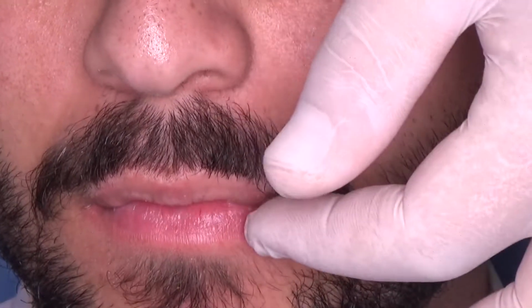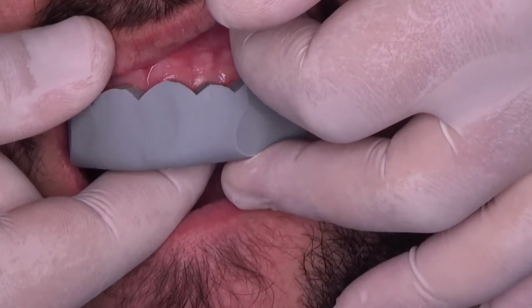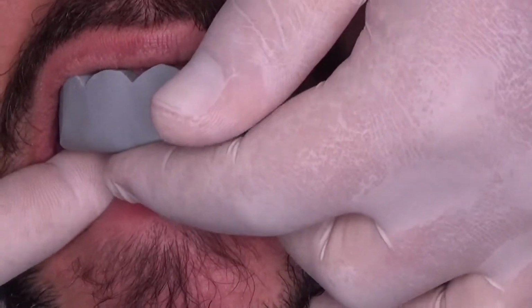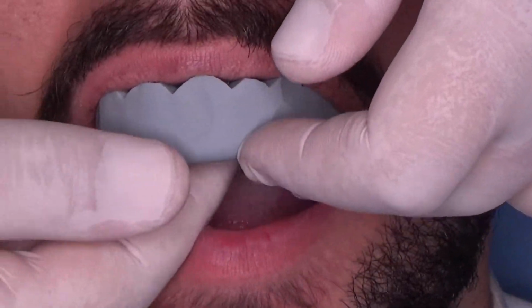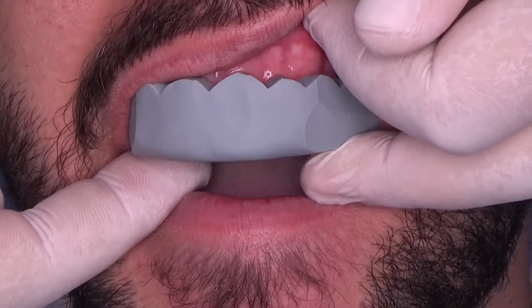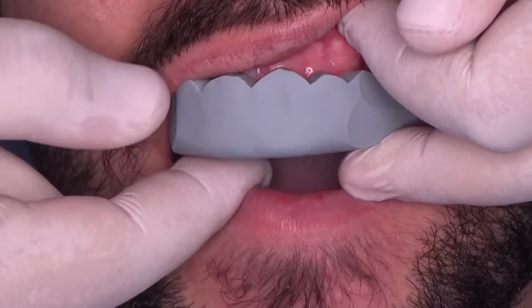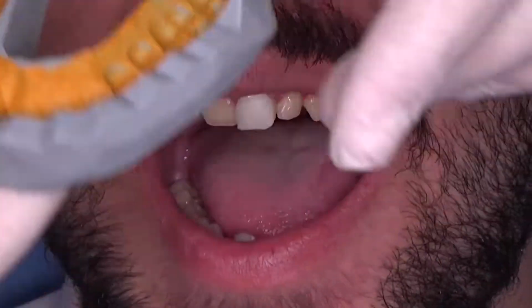Let me check the mock-up, the silicone. The key should stay stable without any movements. That's why we make it on the whole arch. You keep the old mock-up, or you remove it? Or now only try? I will remove it now. It is in the mouth. Of course, I will remove it now.